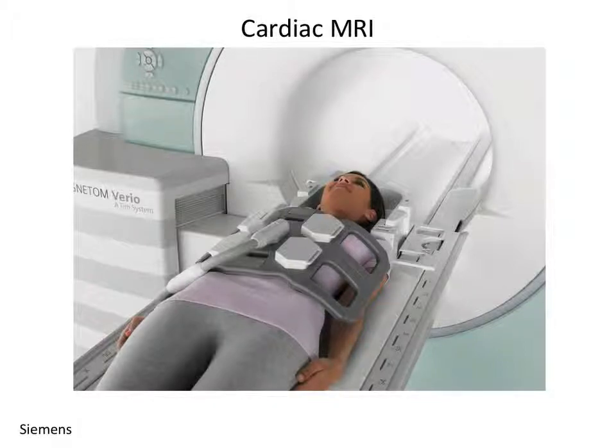So one of the issues with MR, and a practical issue, is you have to lie down in this magnet. You have to lie still and be fairly comfortable sitting sort of strapped down in a cylindrical tube. And so for some people, that's a non-starter. They can't do it. Other people just fall asleep. But as we'll see, you have to get the patient on your side, and they have to suspend their respiration for sometimes up to 15 seconds so that you keep the heart in the same position, at least with respect to respiratory motion.